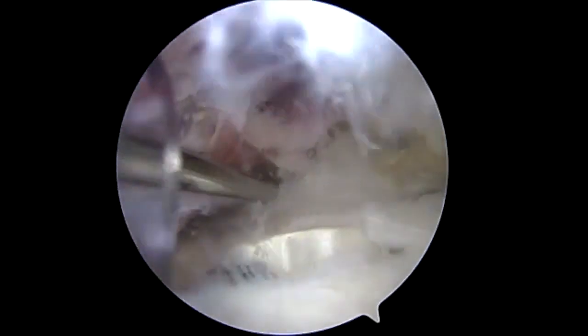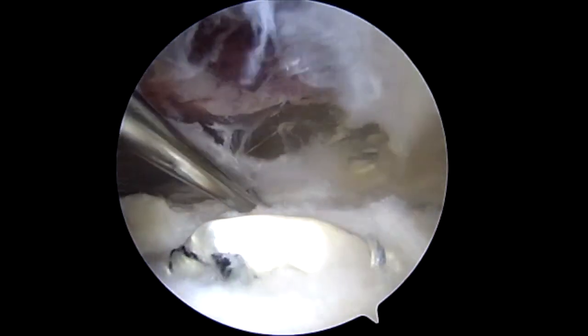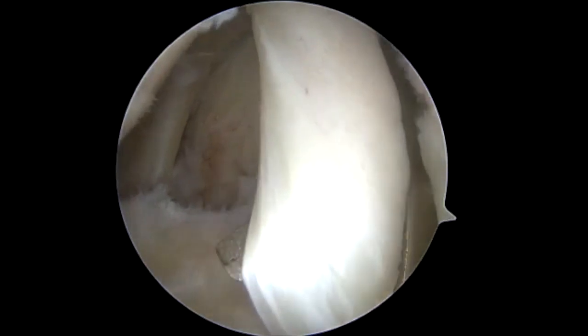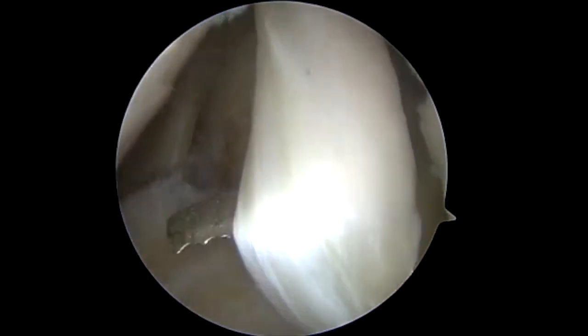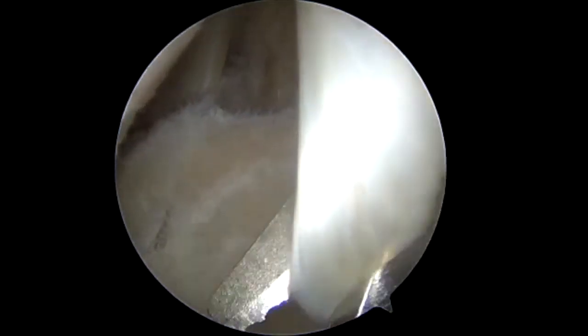The arm is rotated to demonstrate stable soft-tissue fixation of the biceps tendon. Finally, the glenohumeral joint is revisited and the biceps tendon is tenotomized at its origin at the superior labrum. The residual stump is debrided. This concludes the procedure.